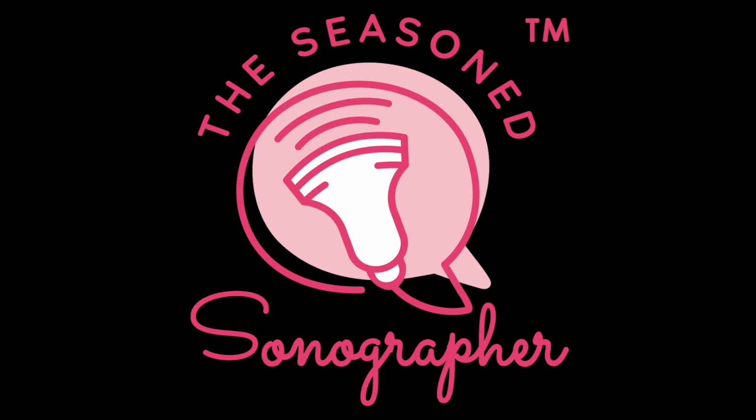The gestational sac. When you're looking at the gestational sac, you want to make sure that it's within that endometrium, high up within that cavity. The shape and the contour should be round and smooth. You should see that decidual cast or decidual ring around it. If you do not see a fetal pole and you see the gestational sac only, you want to measure and get the mean sac diameter of that sac. In all three dimensions, you'll measure that sac.